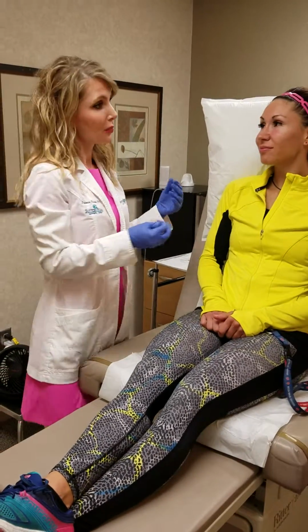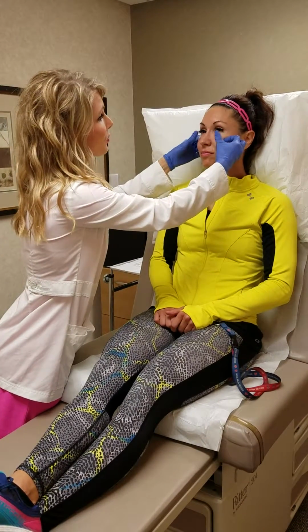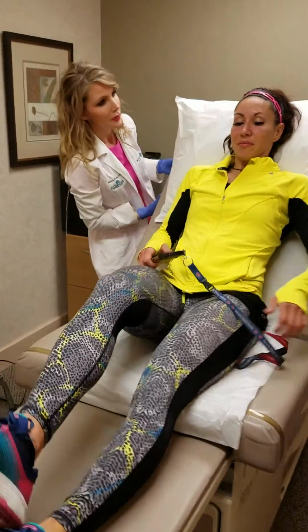Okay, now we can jump right into Dysport, or we can stop and do something else. I mean, what do you guys think? Jump right into doing Dysport? If you're ready, let's do it. I'm ready. Okay, so I'm going to lower you back just a little bit. Okay. I'm going to change my gloves.